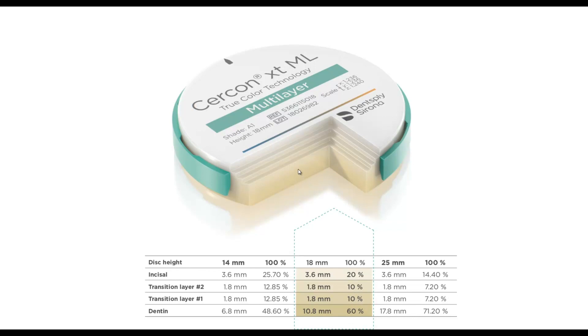And 60% dentin — that's for an 18 millimeter disc. You can see the breakdown for the different disc heights of 14, 18, and 25 millimeter. You can see the 25 millimeter has more dentin in it. These transitional layers help us to get a lot truer shade, in my opinion.